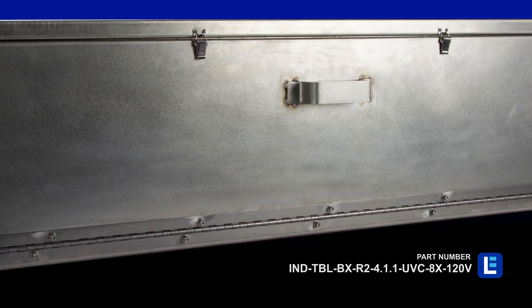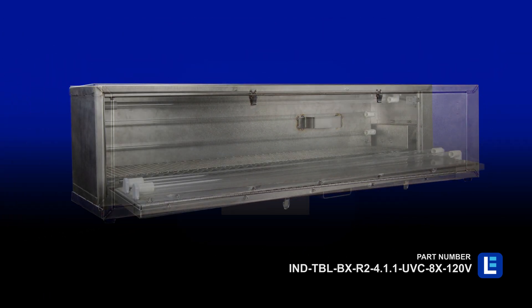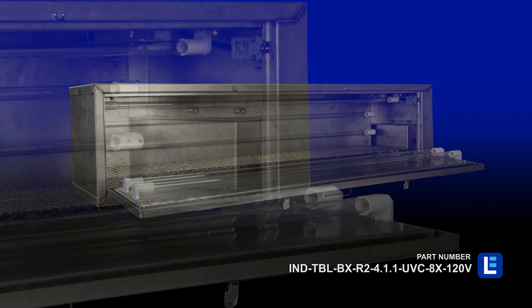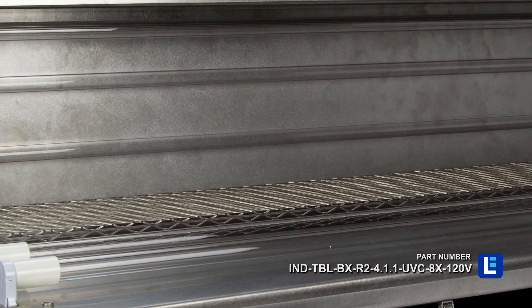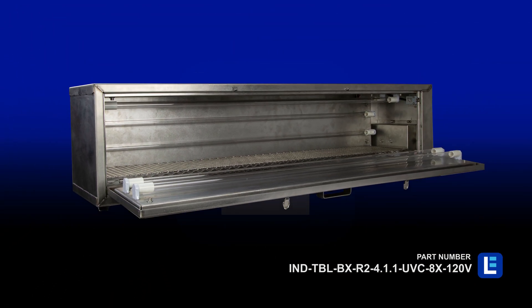The lights emit a flood beam pattern and have an expected lifespan of over 8,000 hours. Inside the box, the UV system offers 360 degrees of coverage. The unit has a wire shelf inside the box for mounting of devices. With the short exposure time at full capacity, multiple devices can be purchased to clean several items at the same time.